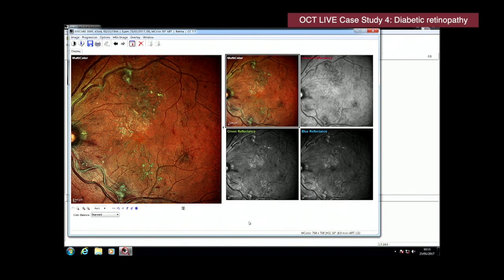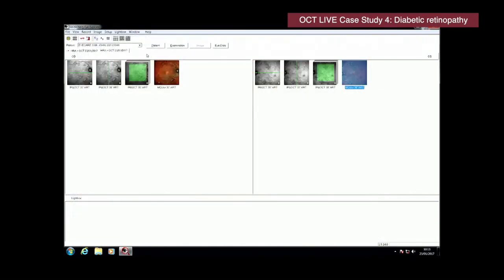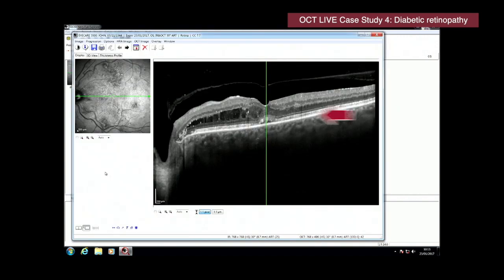And we'll have a look at the OCT scans that we performed, Phil, very quickly because we are running out of time. And we've been reminded. Okay, and again, we're seeing evidence of intraretinal fluid, again in the nuclear layer, in the outer plexiform layer, anterior to Henle's fiber layer. And we've got a little bit of subretinal fluid here and some macular thickening.